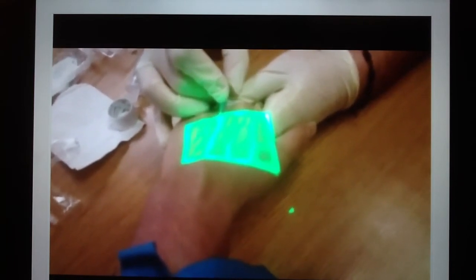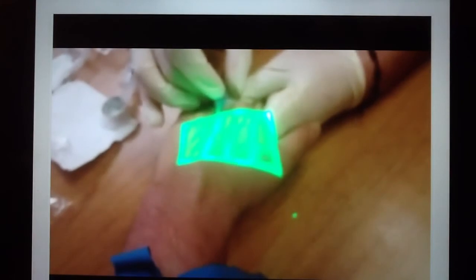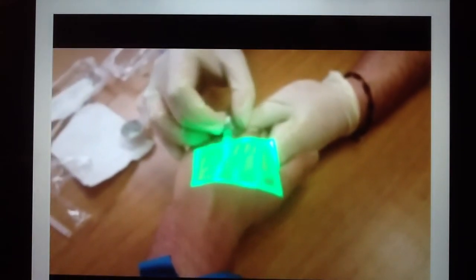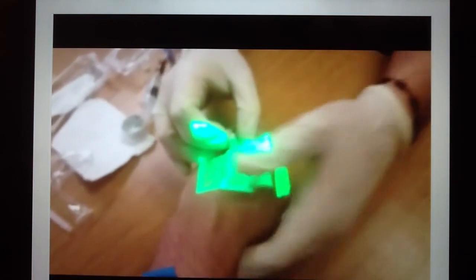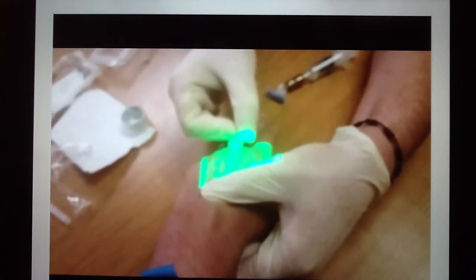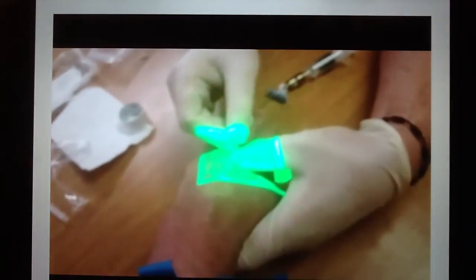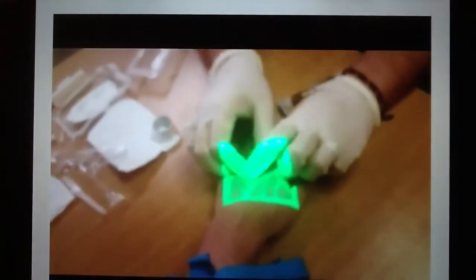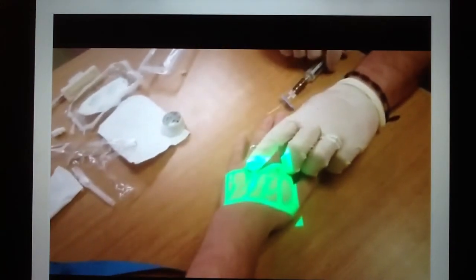Upon seeing flashback in the cannula, I further advanced it into the patient. Placing my thumb above the cannula ensures no blood flow will occur, and then I attach the secondary tubing. Once attached, you need to release the rubber band tourniquet, otherwise you will compromise the vein. I then flushed with 3 milliliters of normal saline, and good patency occurred.